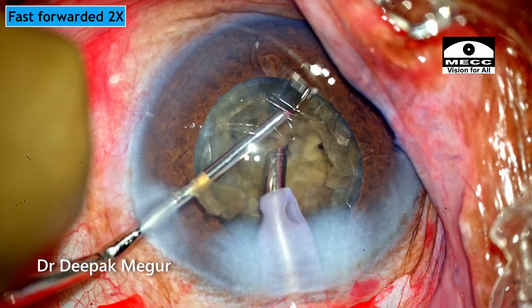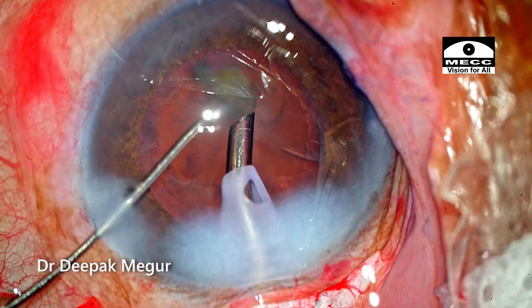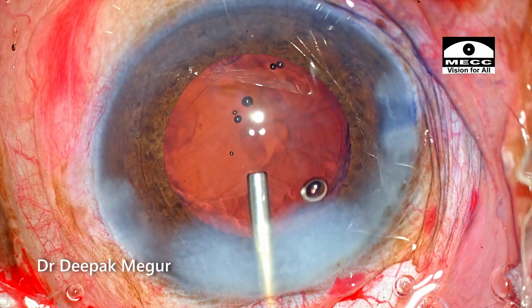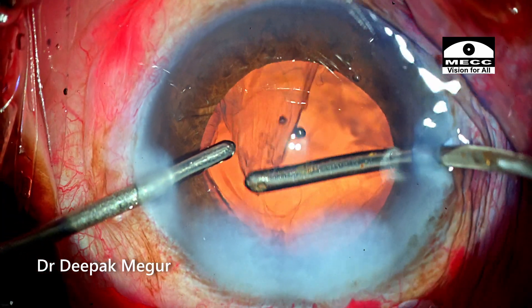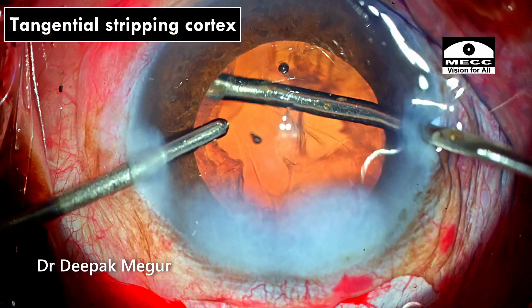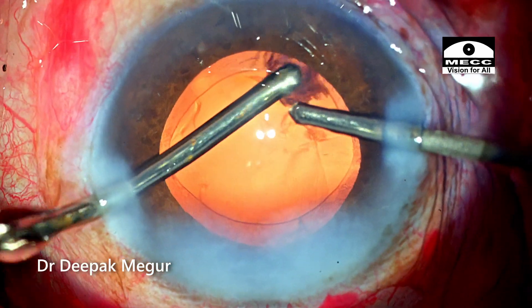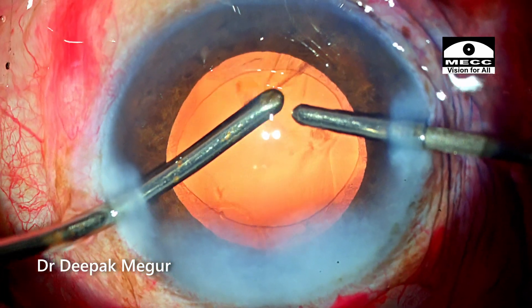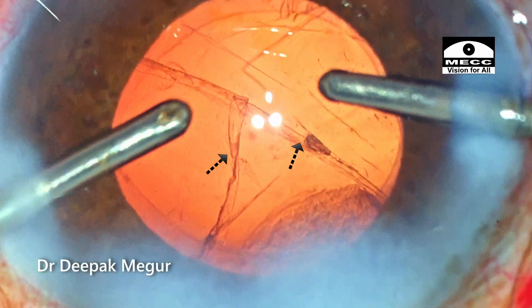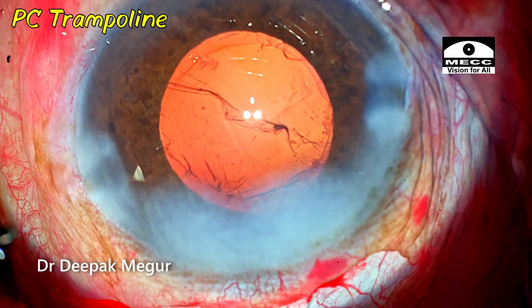I'm going to fast forward the nucleus management. The last part of the nucleus is aspirated without much fuss. Time to deal with the cortex. I need to be aware that I might be dealing with a loose bag here. I'm using a tangential technique for stripping the cortex. As I'm aspirating the last part of cortex, suddenly I see a line inside the posterior capsule — it looks like multiple folds, and this was discomforting.